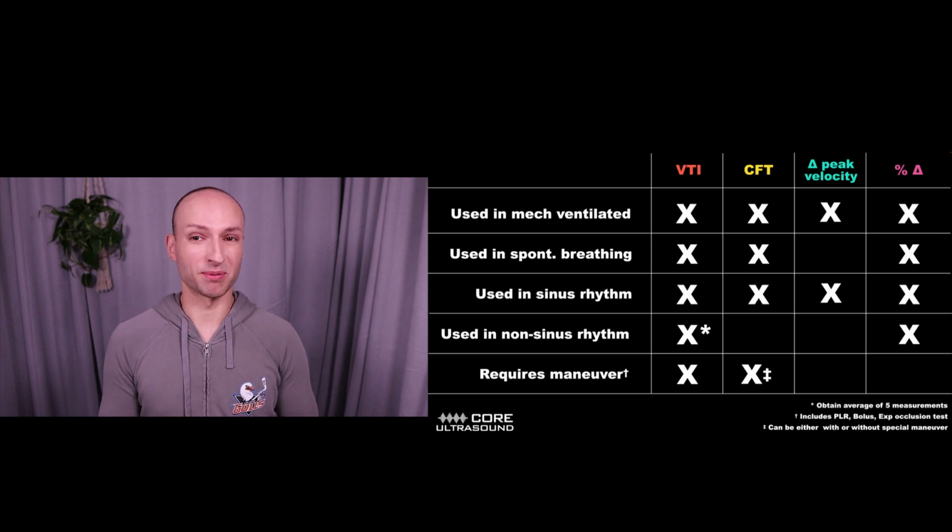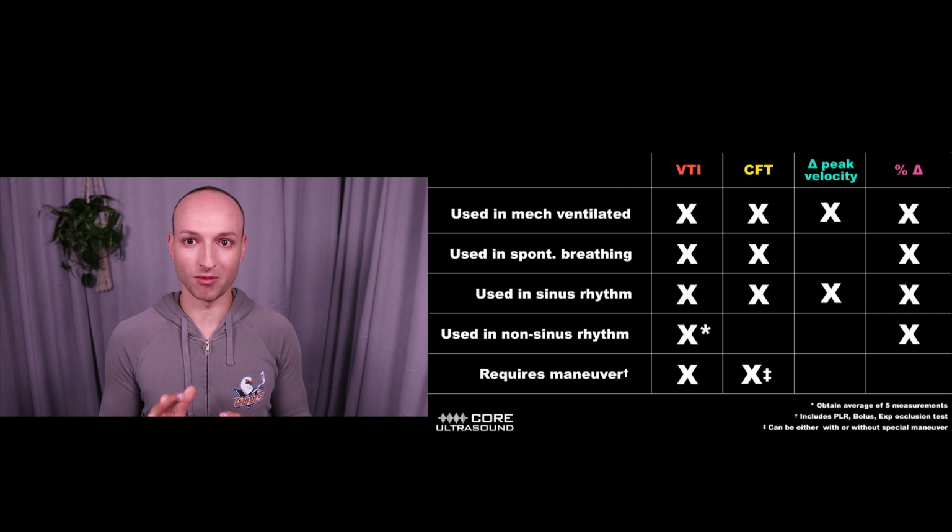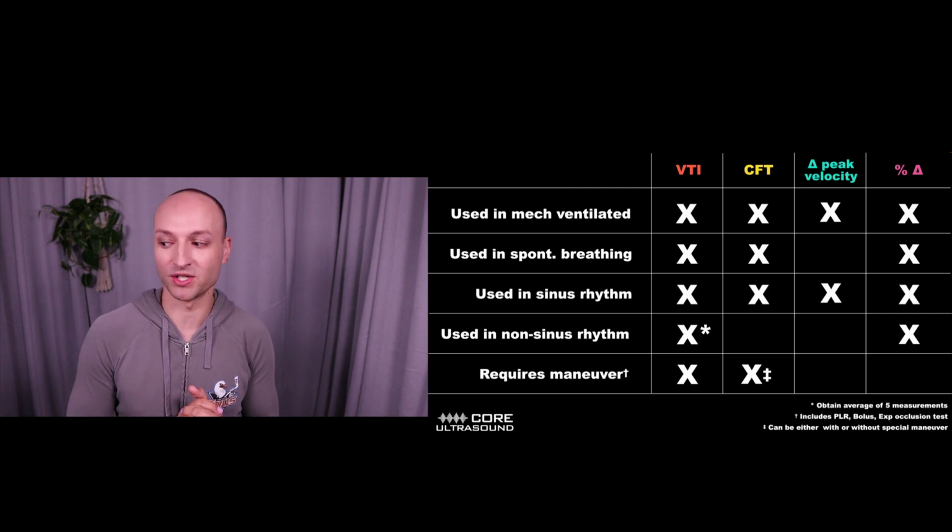What I like is percent change, and specifically with the IVC. This one's actually been shown to be useful in patients with arrhythmias, which is actually pretty sweet. Now, I know IVC is a bit controversial. I'm going to talk about why I think it's okay to use in certain situations.